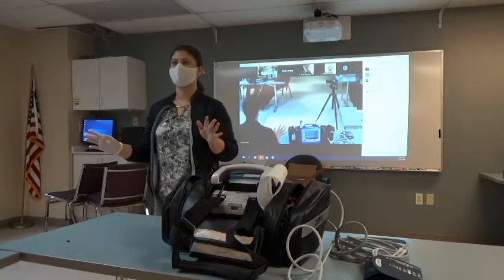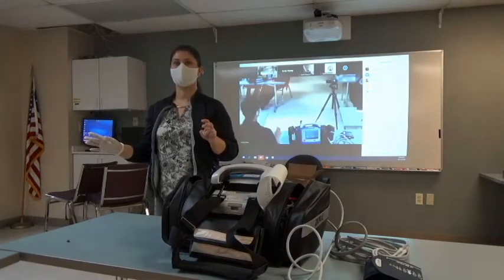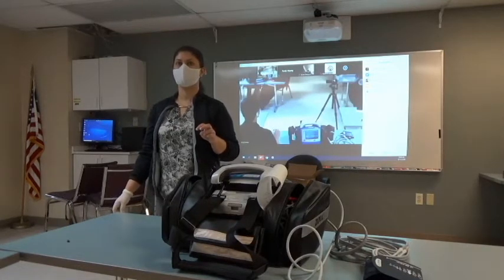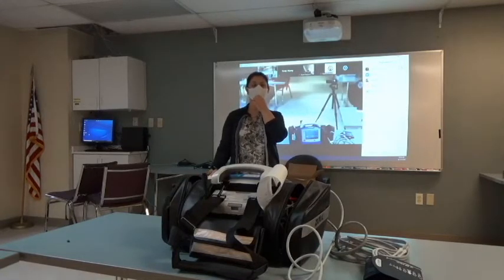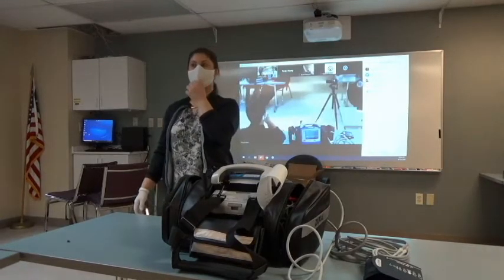Can you guys press one so I can see what it does? Does it do anything on the front? Does it say like add an event or anything? No, it does not say add an event. It'll just timestamp it so it pulls into your EPCR and into your code summary. Okay.